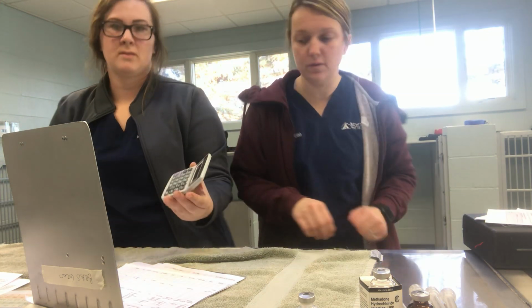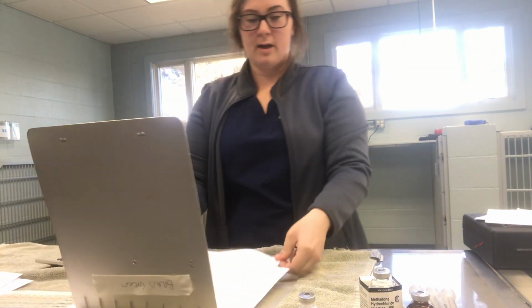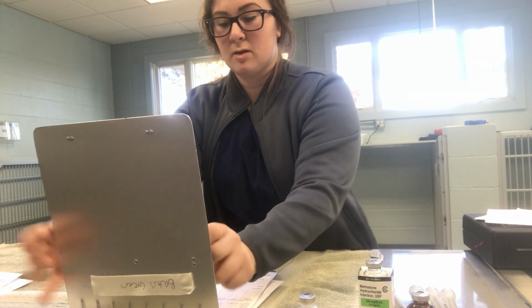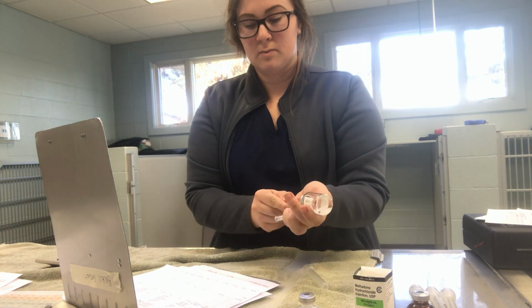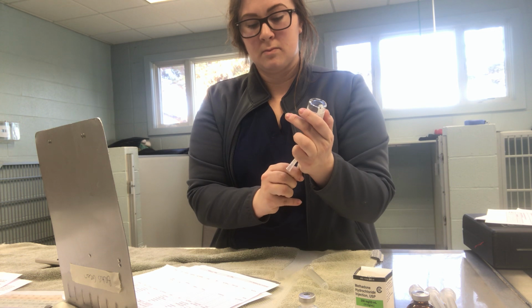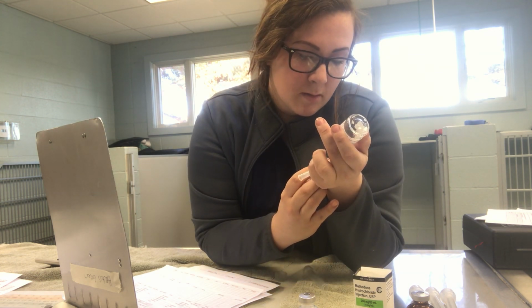0.04, right? 0.04. Okay, so you can see she got 0.04 as well. So we're going to go ahead and we'll draw up the drugs. I have my stickers here for the bottles. So we'll draw up the methadone first. So 0.04.